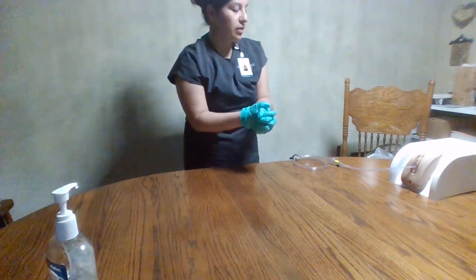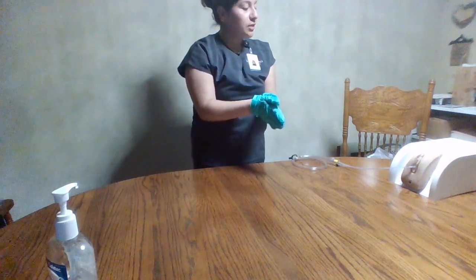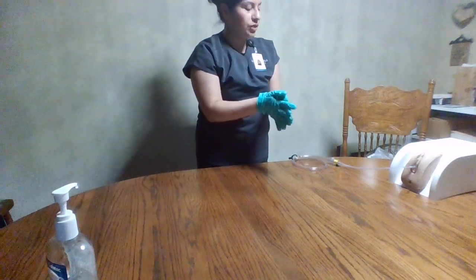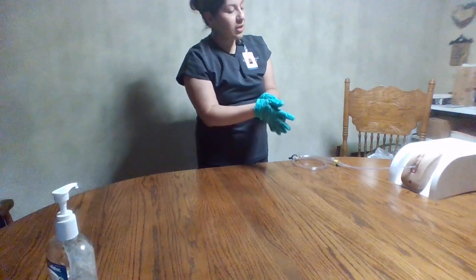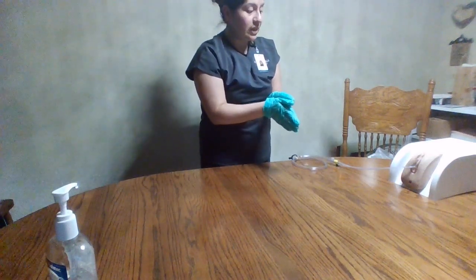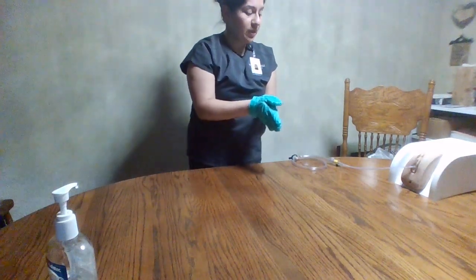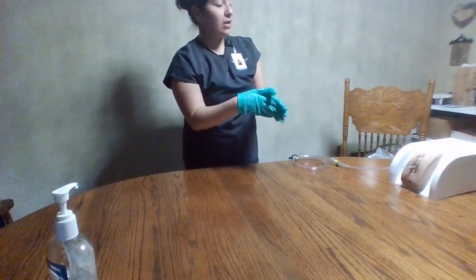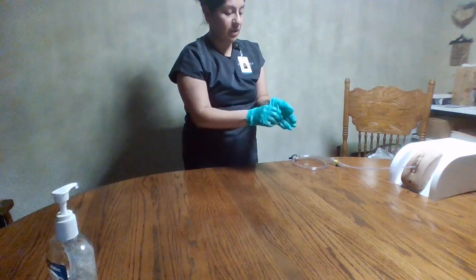I do want to let you know of just some precautions with your Foley catheter bag. If for any reason you do have to move, please give me a call. We just want to make sure that you have assistance because the Foley catheter bag can be a little bit of a safety issue. Now, if for any reason you do feel that there is any tugging, there's no slack, please let us know as soon as possible. And also, the catheter bag should remain below your bladder at all times. So please make sure it's left in that position.